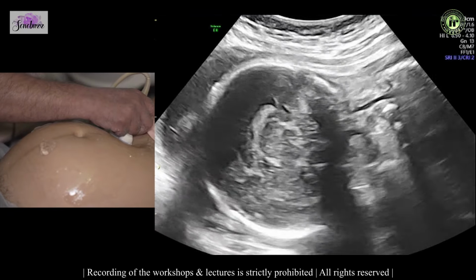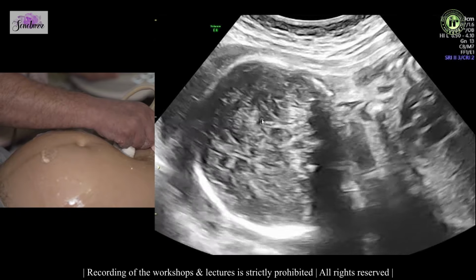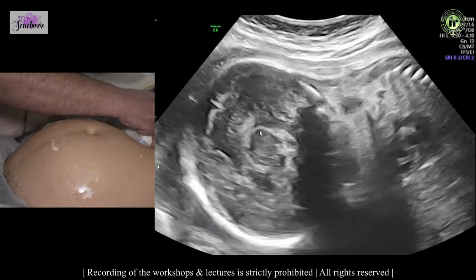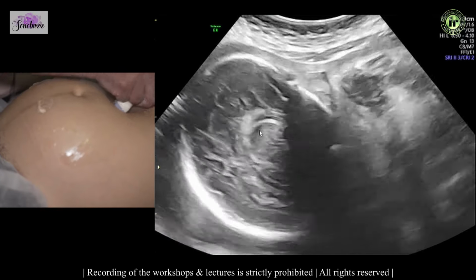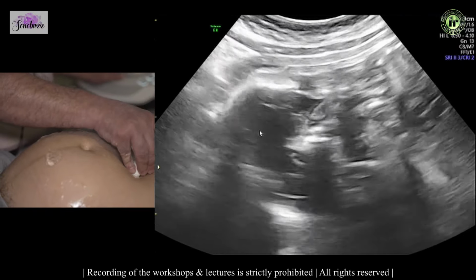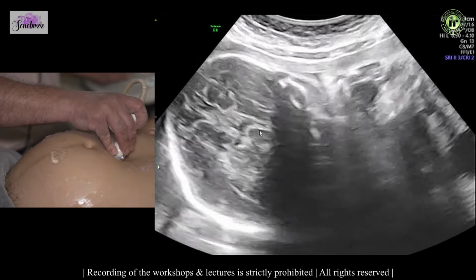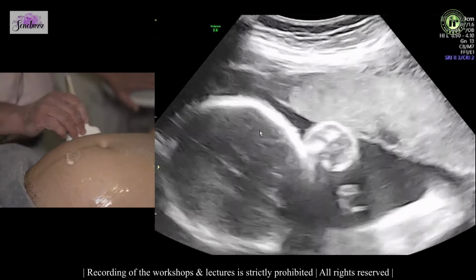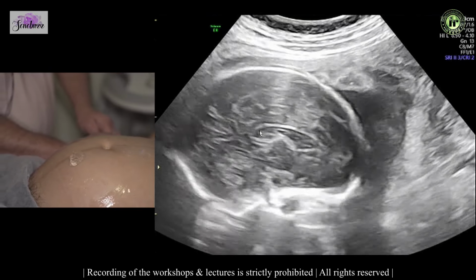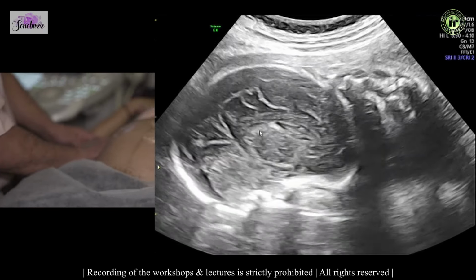That's the sagittal view showing the choroid plexus in the lateral ventricles. These are the sulcations. I am trying to come in the midline. The fetus is a little bit flexed. And we're not getting a very good sagittal view, so we'll just see from the other side. Yeah, this is a better view. You can see the corpus callosum beautifully now.